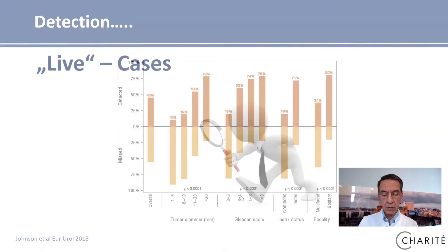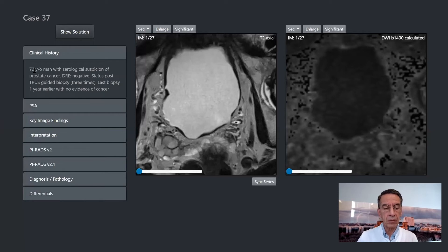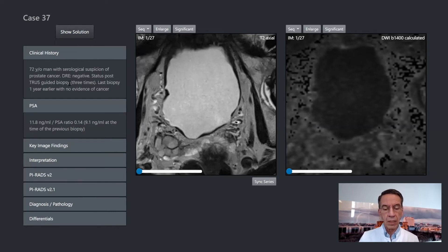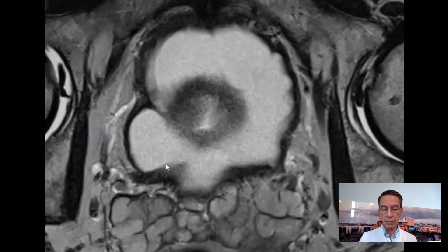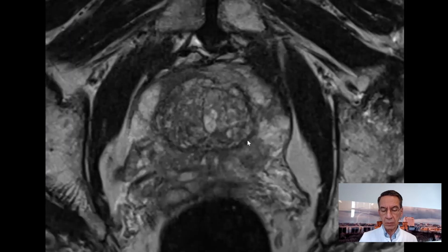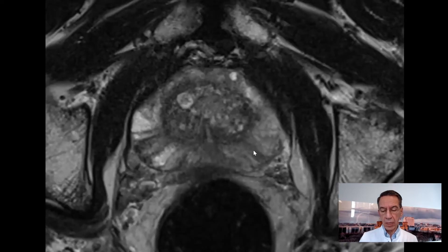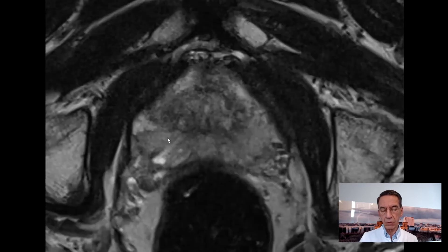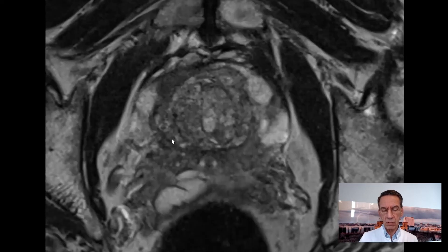Now let's have a look at two interesting cases. The first is a patient 72 years old with serological suspicion of prostate cancer because of the PSA, which is continuously increasing. Digital rectal examination is negative, and this patient had already three systematic TRUS-guided biopsies which were all negative — the last biopsy was one year ago. Let's have a look at the T2-weighted sequence. We see the BPH of the transitional zone and then the peripheral zone with some signal inhomogeneities, linear, wedge-shaped. But I'm not very concerned about these areas because the urologist was already with his needle there.